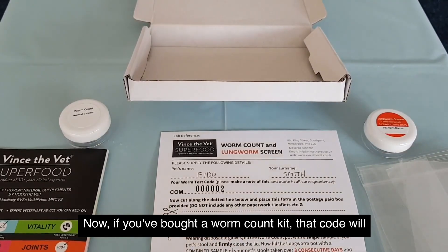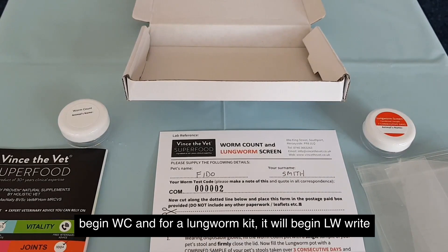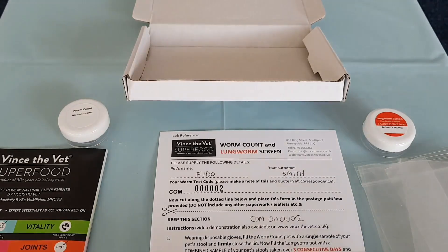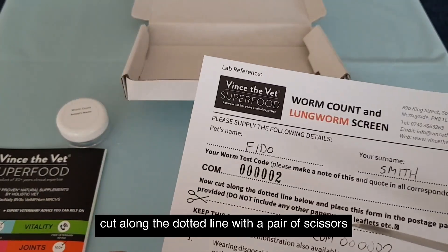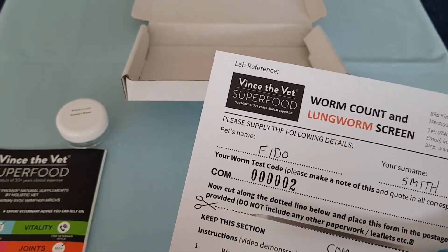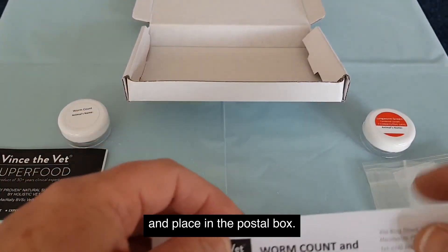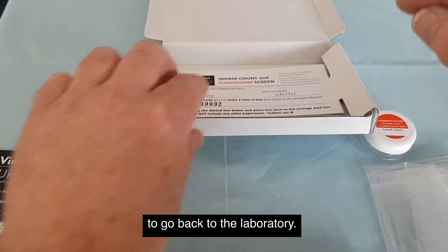If you've bought a worm count kit, that code will begin WC. And for a lungworm kit, it will begin LW. Write the entire code down below the dotted line. Next, cut along the dotted line with a pair of scissors and place it in the postal box. That's the only piece of paperwork to go back to the laboratory.